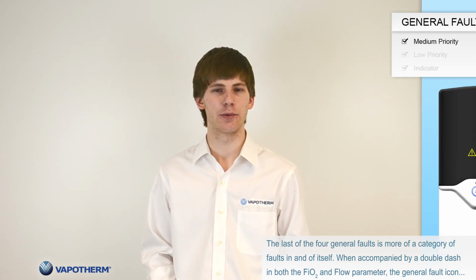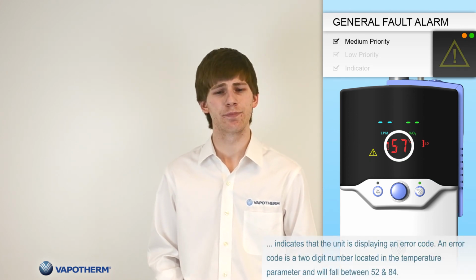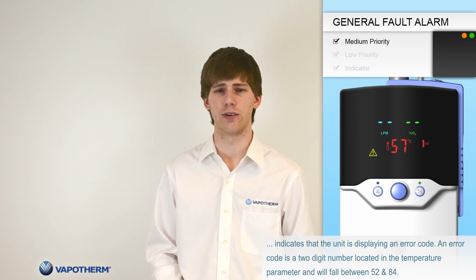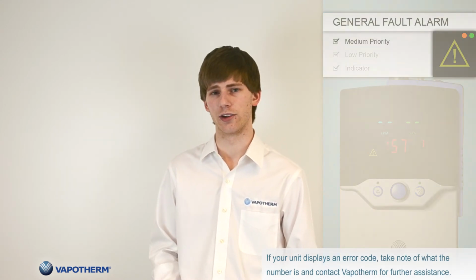The last of the 4 general fault alarms is more of a category of faults in and of itself. When accompanied by a double dash and FiO2 and the flow parameter, the general fault icon indicates that the unit is displaying an error code. An error code is a 2-digit number located in the temperature parameter and will fall between 52 and 84. If your unit is displaying an error code, take note of what the number is and contact Vapotherm for further assistance.